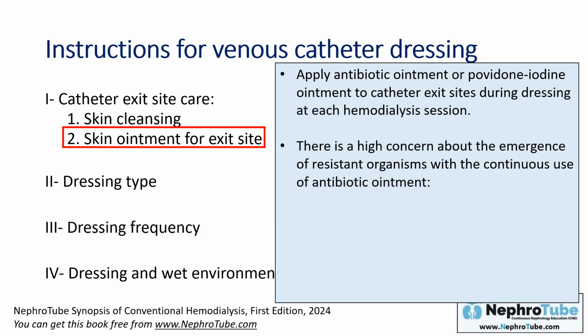That's why other strategies are suggested to decrease the incidence of this resistance. The KDOQI 2019 update and the European Renal Best Practice Guidelines in 2010 suggested using the antibiotic ointment only until the insertion site has healed, and not using it with every session forever.